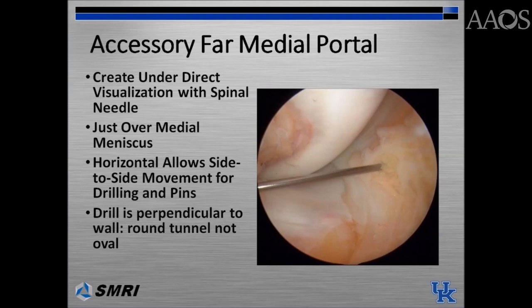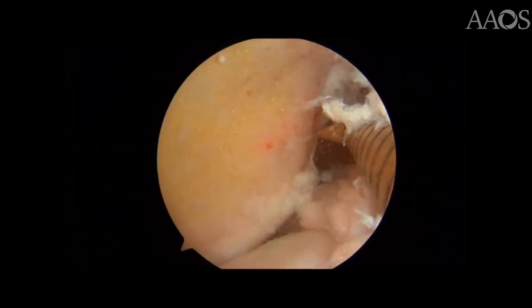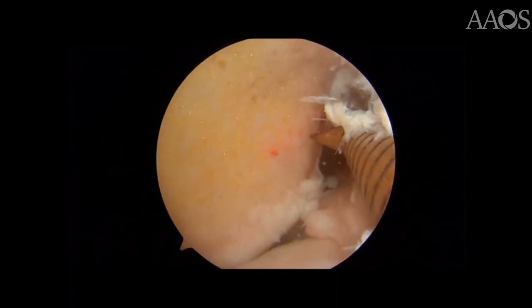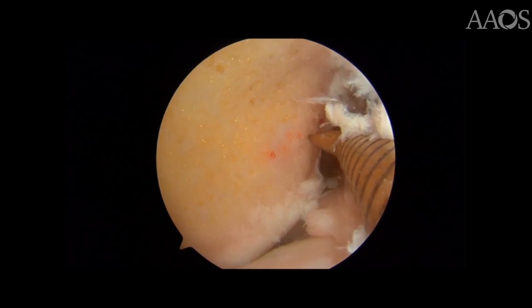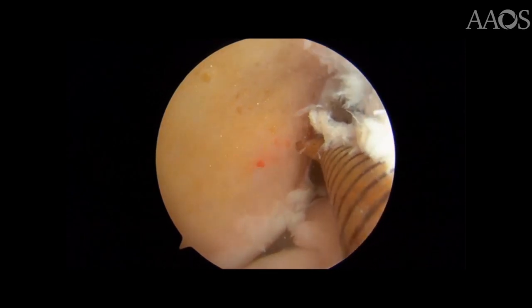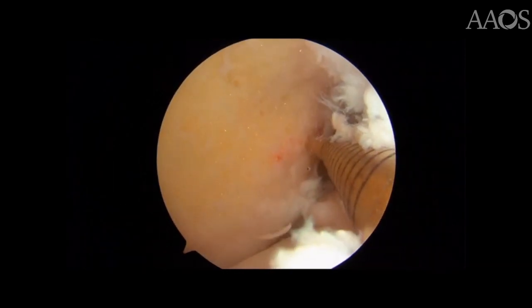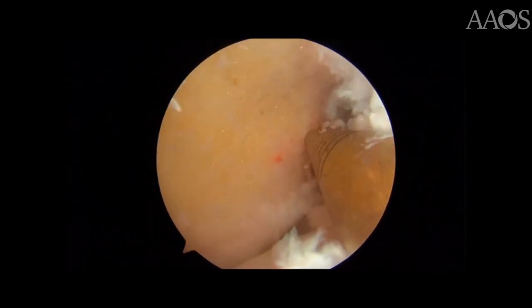It is also crucial to ensure that the drill is perpendicular to the wall in order to create a round as opposed to an oval tunnel. A 45-degree microfracture awl is placed through the far medial accessory portal to create a starting point for the femoral tunnel.